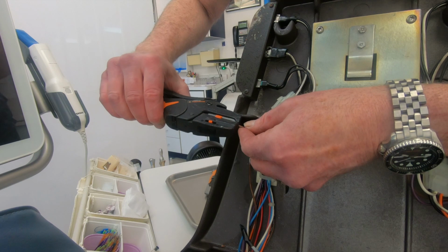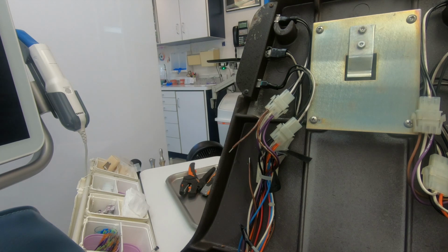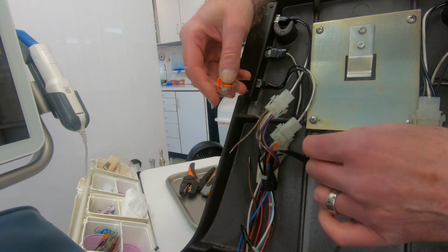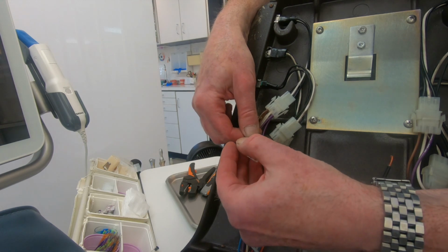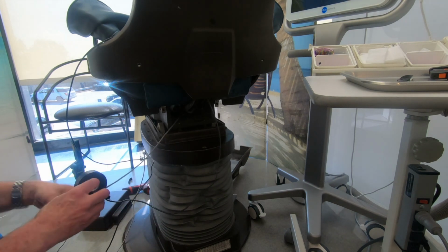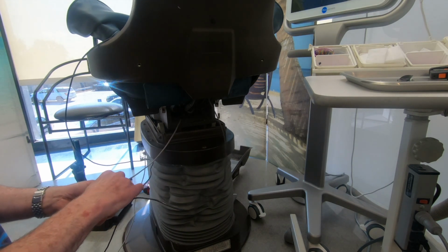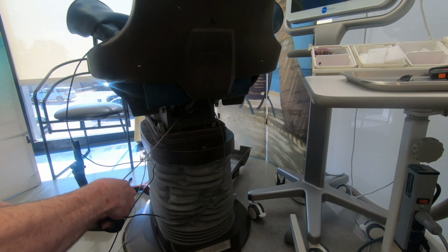So this is the part that needs to be connected. So you'll see, like I said, I did a Wago connector. I happen to have a five-er lying around, but see, so there's the black wire that I'm going to use to run under the chair. So here I'm just using the existing wire that's running under the chair to pull the new wire. So I'm just connecting the temporary piece of junk I put in there to the new wire that's going to be there permanently with some electrical tape, and I'm just going to pull it through from the back to the front.